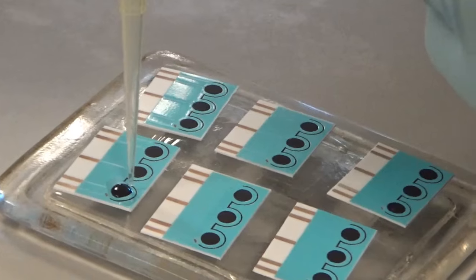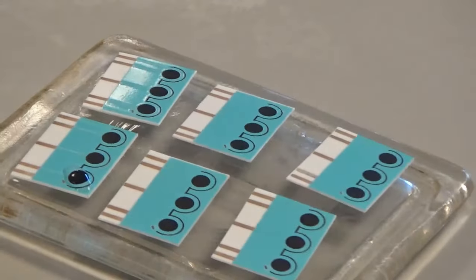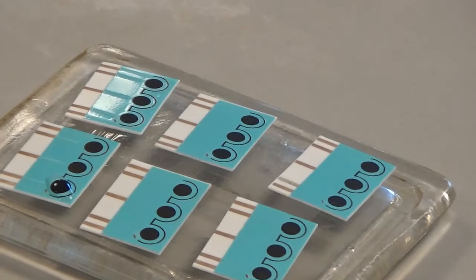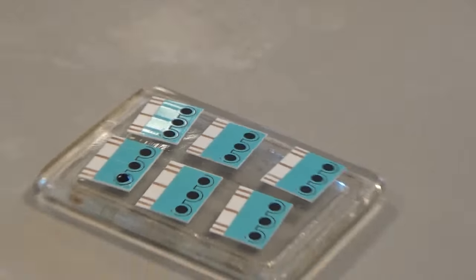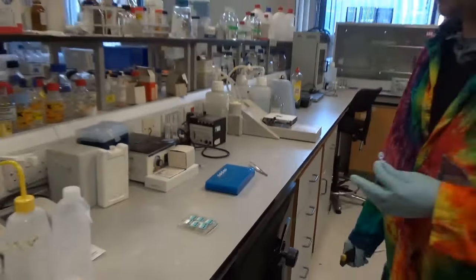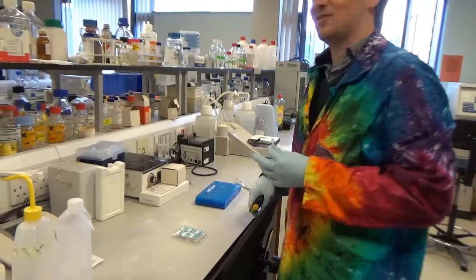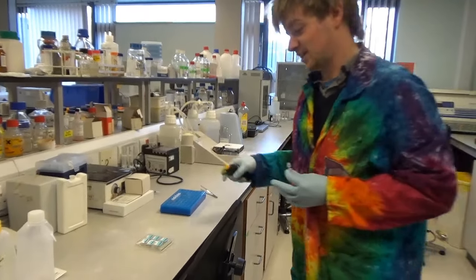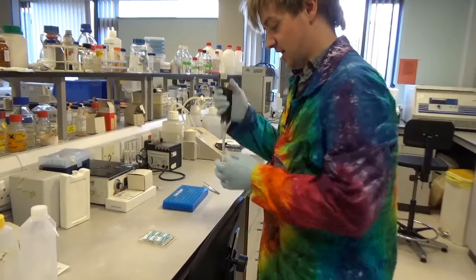so that you don't have to worry about progressing on to, we can treat you medically if you like, rather than you having to have blood tests and the other one where they take a bit out of you, but I forget the word of. Yeah, biopsy, thank you. So you don't have to have blood tests and biopsies, you can just literally take this electrode, dunk it into your urine, it will tell you whether or not you've got kidney disease.